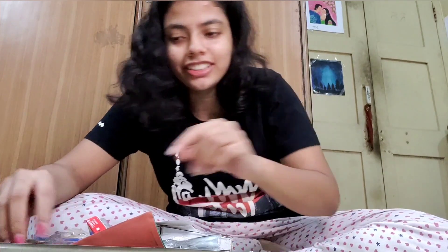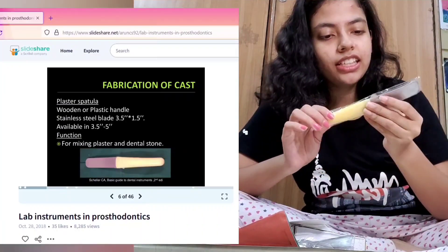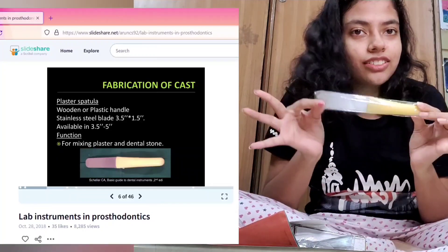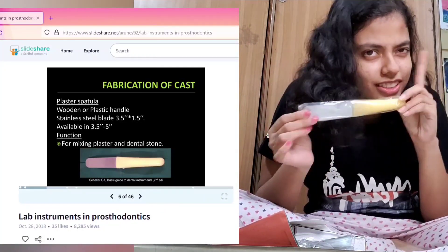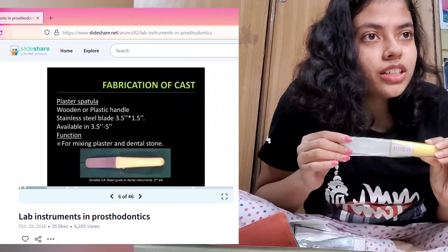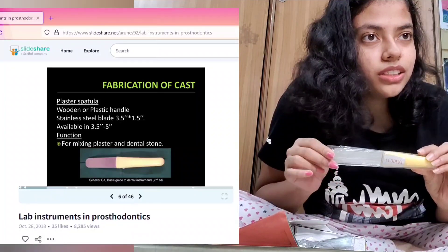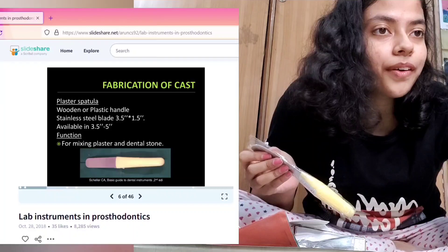First things first, we have fabrication of casts. A plaster spatula — which has a wooden or plastic handle, plastic in this case — this is the spatula. It has a stainless steel blade available in 3.5 inches to 5 inches, used for mixing plaster and dental stones.